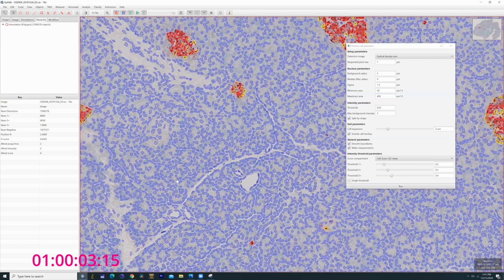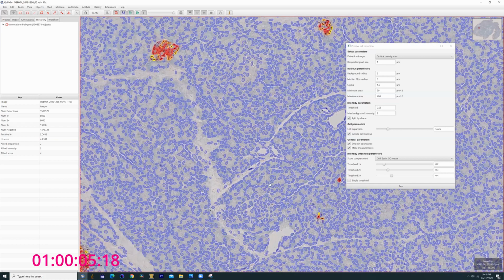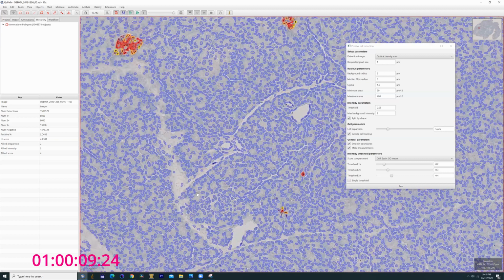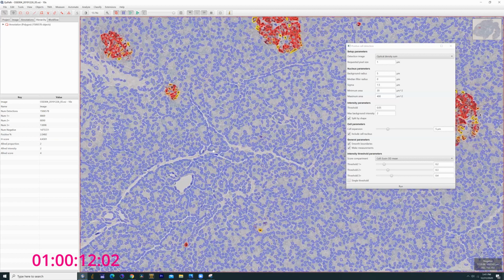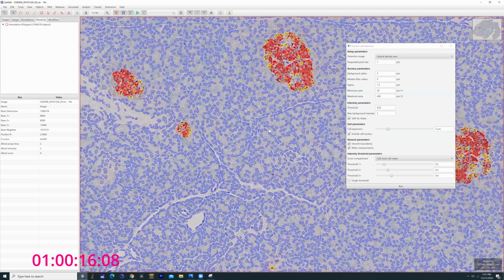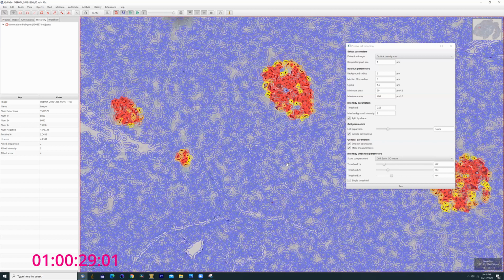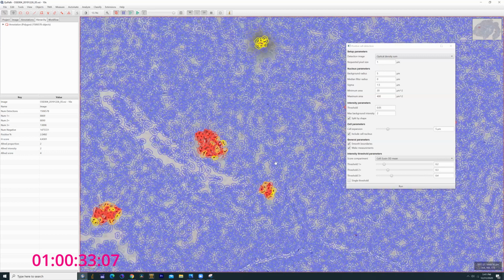What I'm mostly worried about here with the nuclei, like I said, is this connective tissue. Anyway, like I said, it's a trade-off. It pushes our percentages up because we're encompassing a slightly larger section of islets, which is why I'm focusing on them primarily. They are my bread and butter in the end. But put the cell boundaries back in, and you get an idea of what the islets are, the relative intensity.